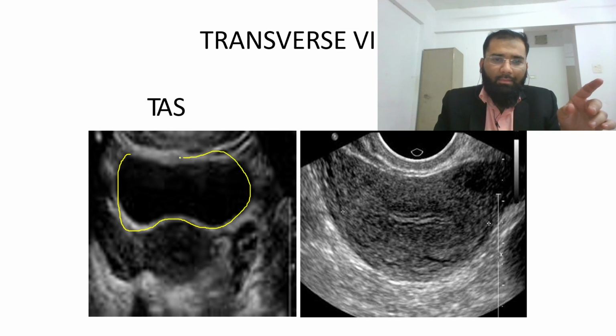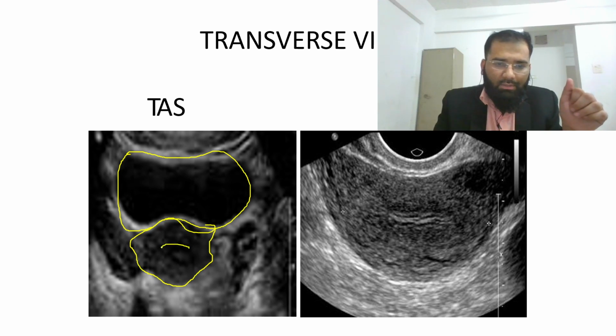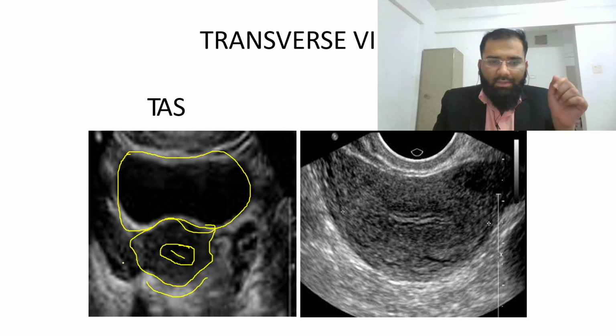Now look behind this organ. This is the uterus. Can you see this in the center? This is the endometrial lining, ET. And behind lies the rectum.